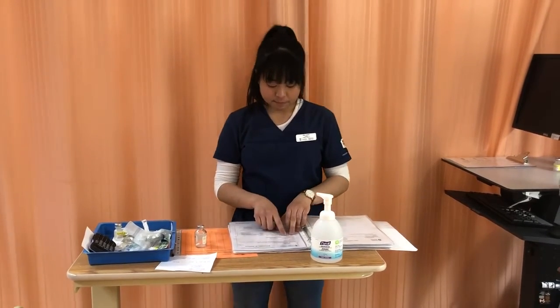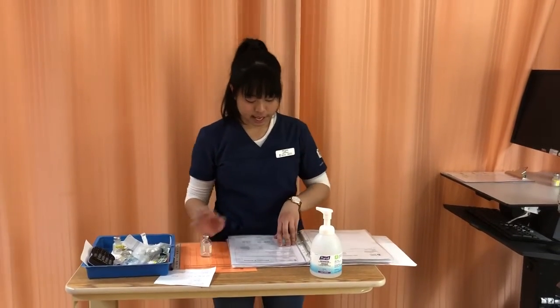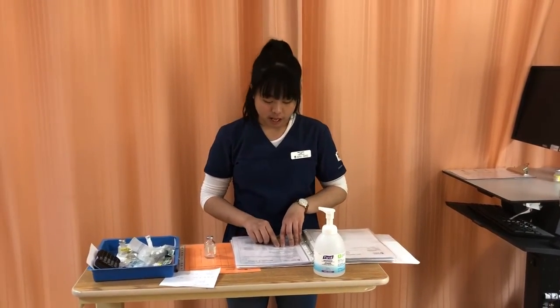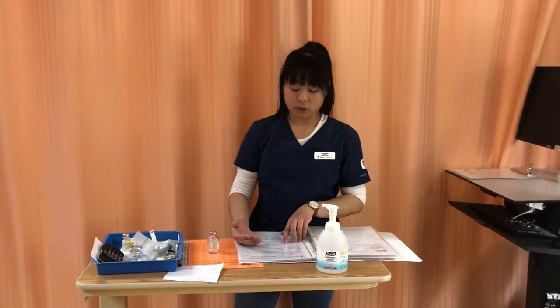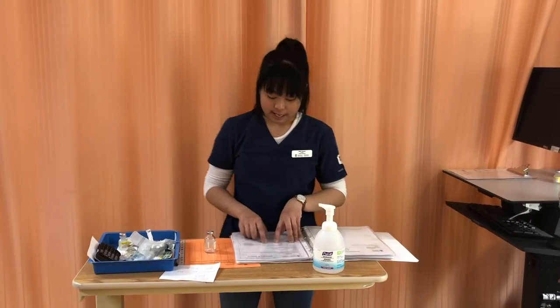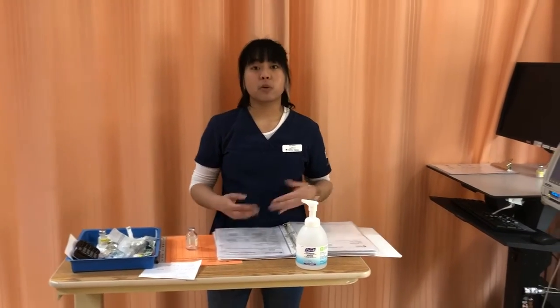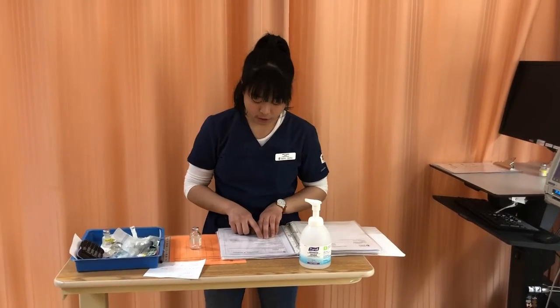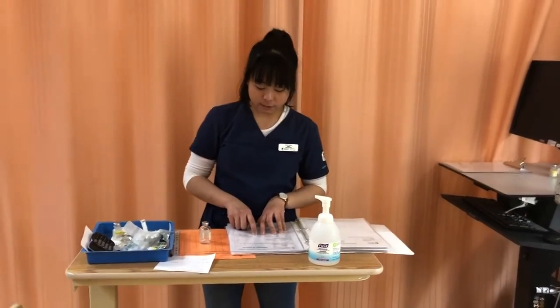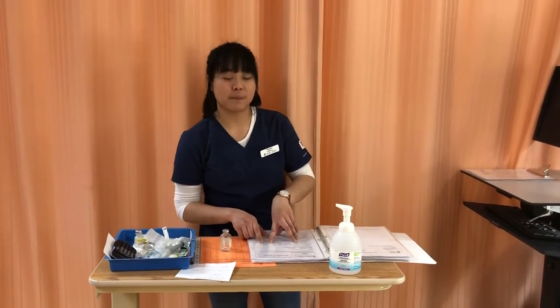Okay, and then it has to be reconstituted. So I have a 5 million unit vial here, and I have 8.2 mLs of either sterile water, normal saline, or D5W, and I will be choosing normal saline for this, as it is the same solution that is running with our primary, so we know that it's compatible. So with 8.2 mLs, the final volume will be 10 mL with a final concentration of 500,000 units per mL.